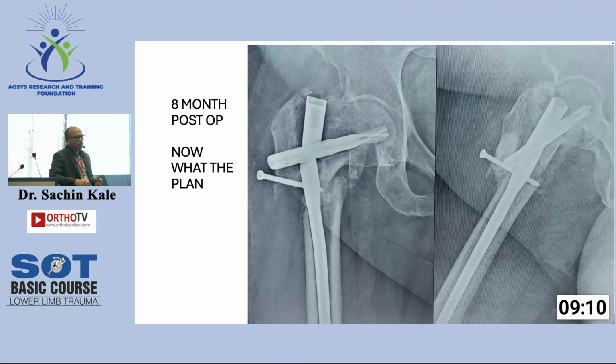Is it simple to remove the implants or any tips and tricks to remove the implant? Sir, we can do a retrograde nailing if we want to. Okay, now first implant removal, then we will do, what's the plan? So in this implant, it will be very simple to remove? No, sir. It is broken into 2 parts. That is why it is difficult.